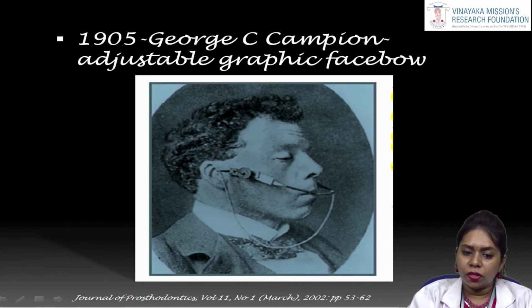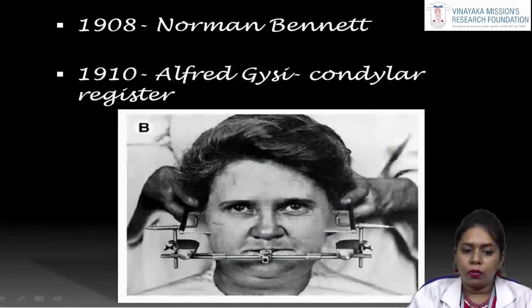Campion designed an adjustable facebow fixed to the mandibular teeth with modeling plastic to graphically record the various positions of the condyle on the face with a suspension of dots. Using white blotting paper, the dots, which were made of thick oil-based dye, were related to the ala tragus line with one edge on the paper and lifted off and transferred directly to either a paper recording or a glass lantern slide.